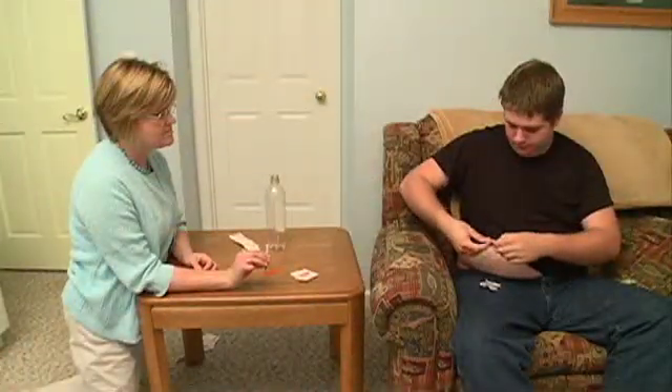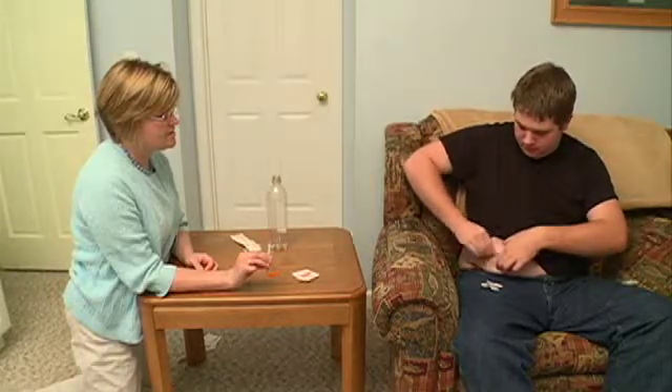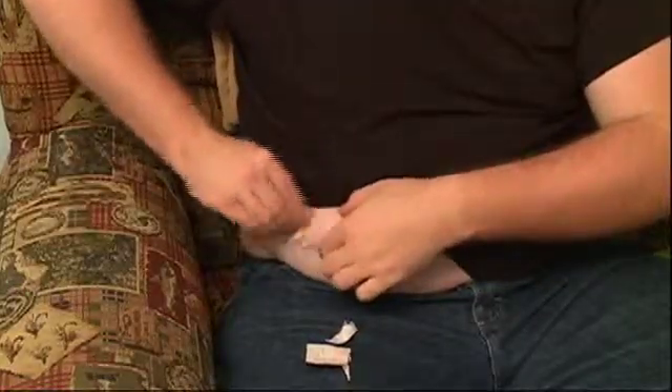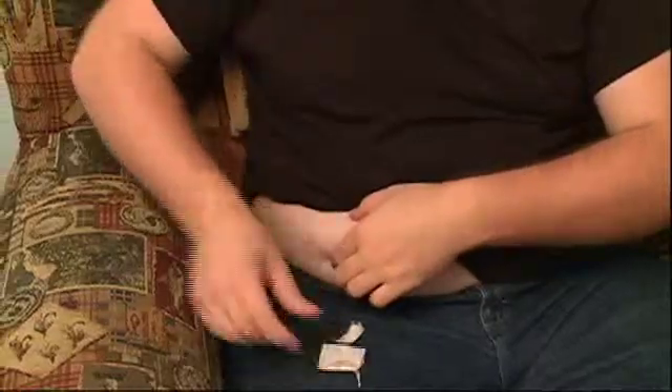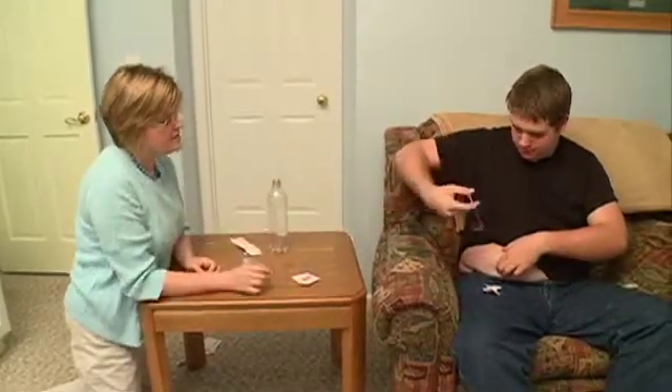Choose an area on your stomach or inner thigh that has the most fat. Open an alcohol swab and clean the skin where you will give yourself the shot.